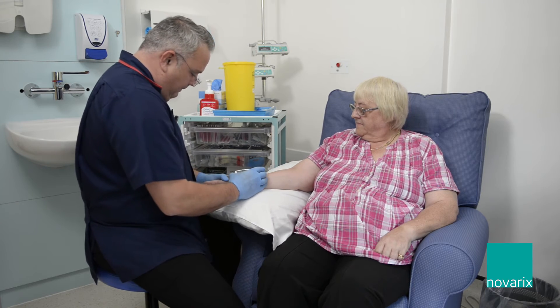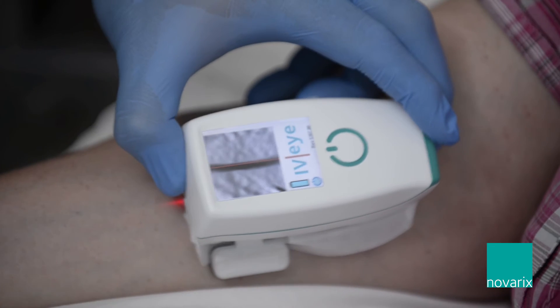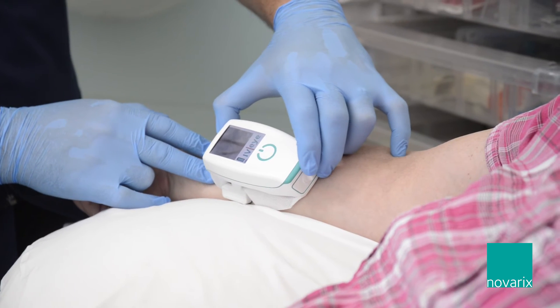When we think about patient groups who benefit most from using the IVI, we think about patients with poor peripheral vascular access who have had repeated vascular access attempts in the past. That naturally lends itself to cancer, chemotherapy, and oncology patients who have had previous difficulty with cannulation.